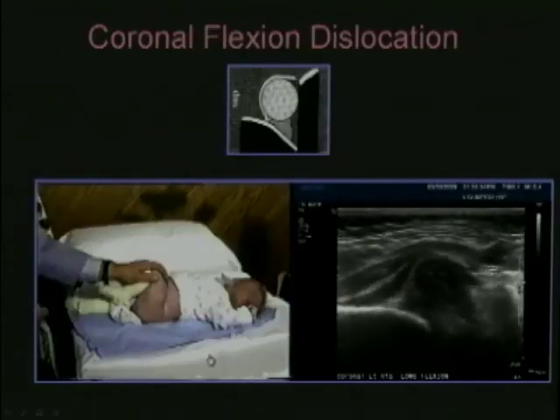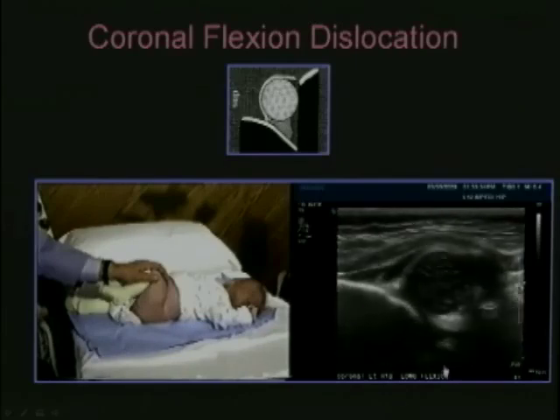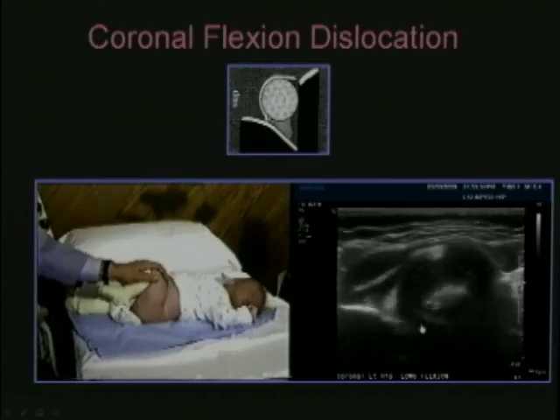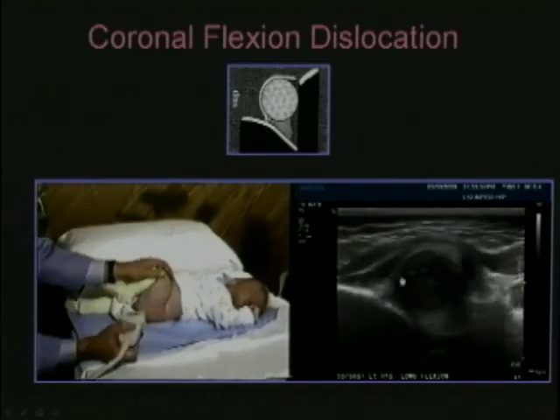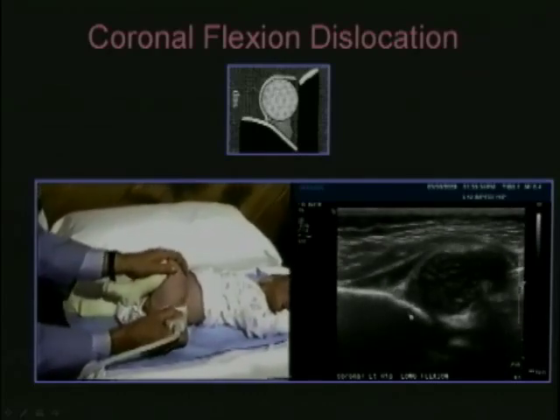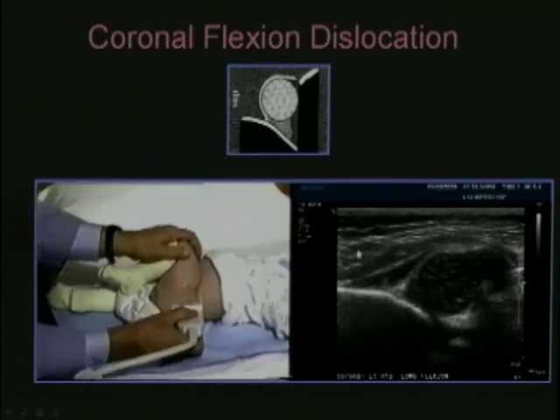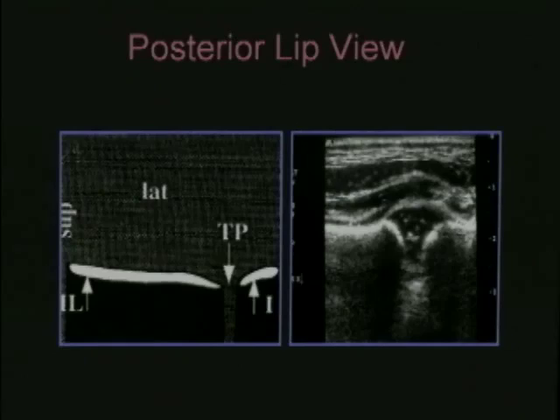So here we are looking at the head again in this baby who, as we will see, is actually demonstrating a totally dislocated head. There's no contact within the acetabulum until the Ortolani maneuver is done, where the hip is replaced into this very shallow acetabulum. There's excess pulvinar and incomplete reduction, but the fact of the matter is it is reducible, and that's extremely important in making a decision as to what to do so far as treatment is concerned.